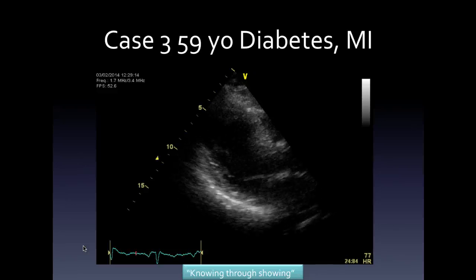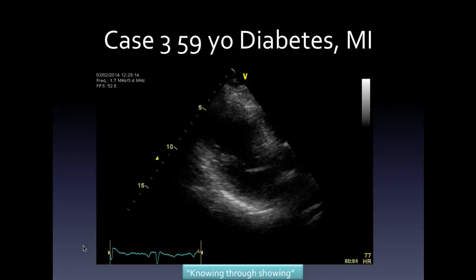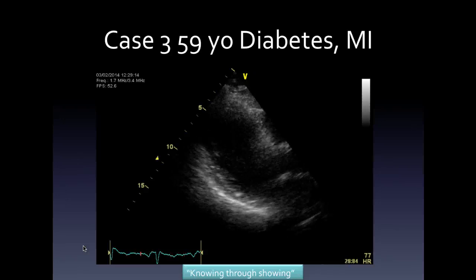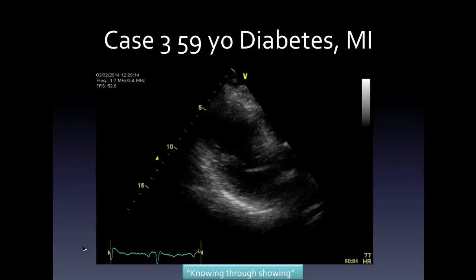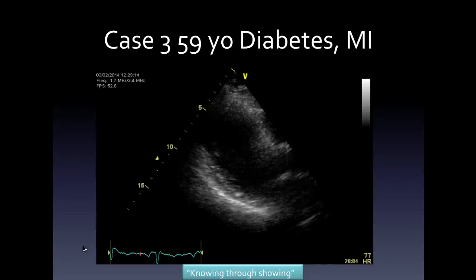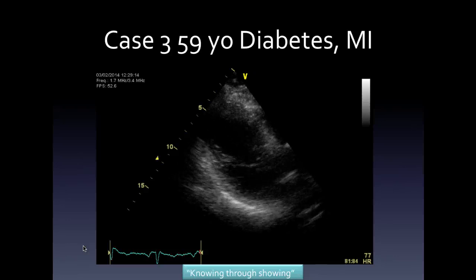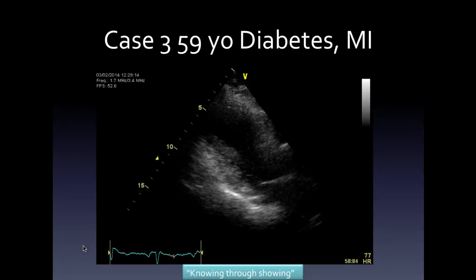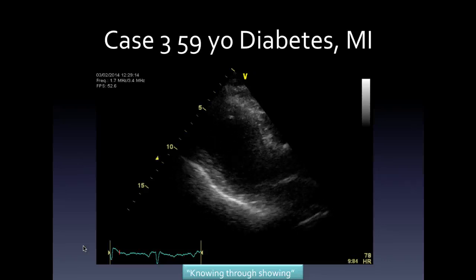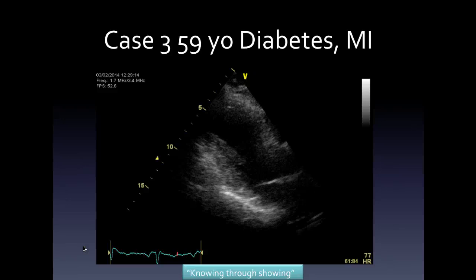As a clinician, we can put all the pieces together quite well. But looking at his echo, this is Roisin's parasternal long-axis view, from a sonographer with 45 years of experience. This is the picture. But if this is what Roisin got, I'd hate to tell you what I got.